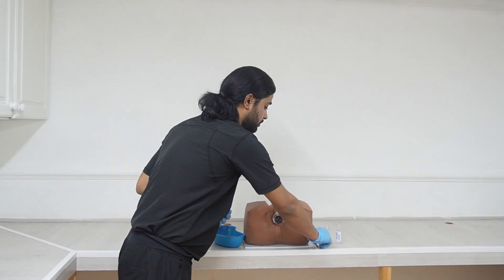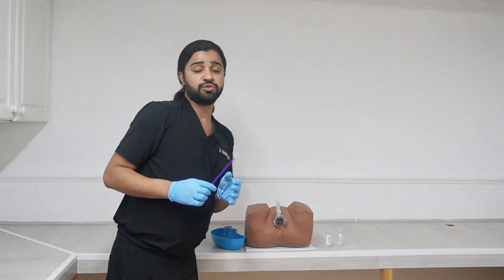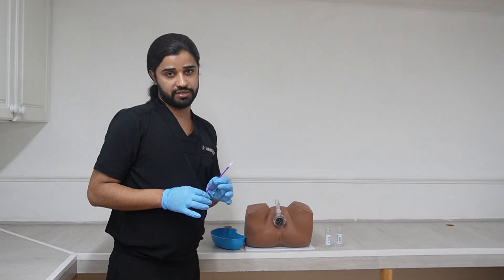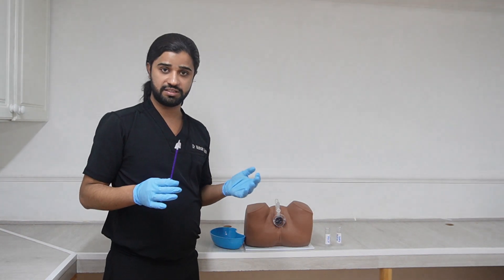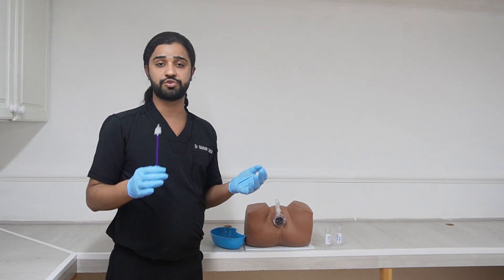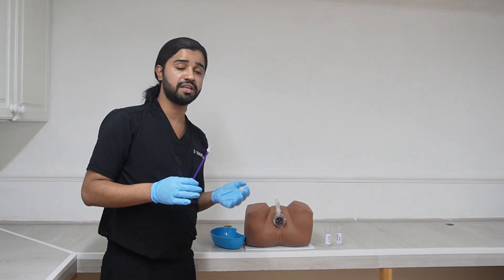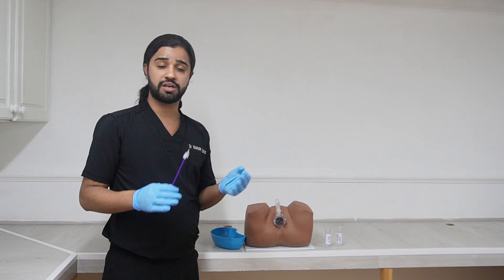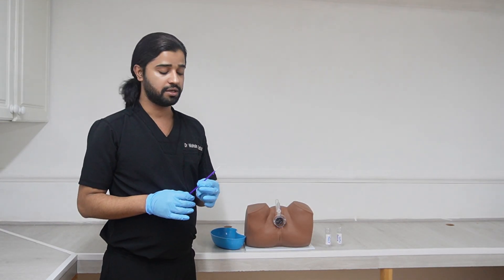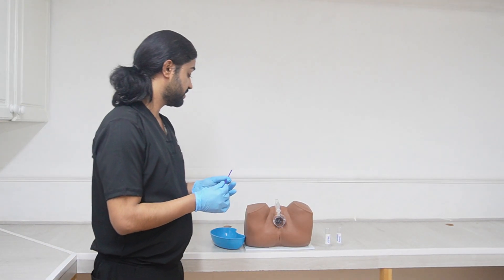If it is indicated to take a pap smear, use the cervical brush. Indications for pap smear are to screen for cervical cancer. Contraindications include: any vaginal bleeding, menstrual bleeding, pregnancy, recent sexual activity, or use of spermicidal gel.